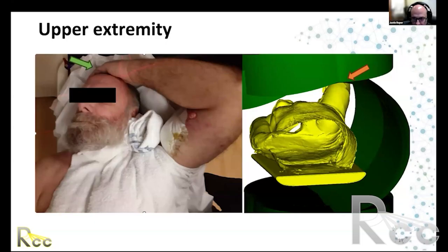Yeah, so this is collision check software that we're using clinically. What you see with the green curves is mapping out the rotation of the gantry. So we're seeing the face of the collimator head as it moves around the patient, which is shown as the yellow surface. And the table is also shown in yellow. This is an instance where the elbow would actually intersect with the gantry as the patient is positioned now. And so clearance is certainly a concern for this type of treatment.